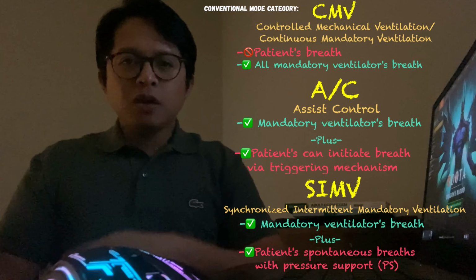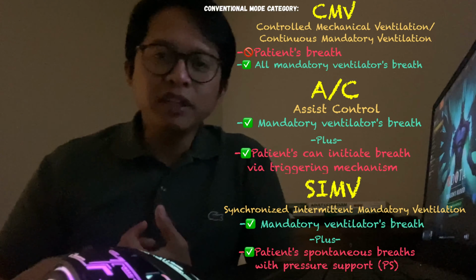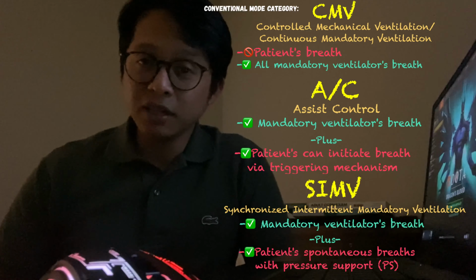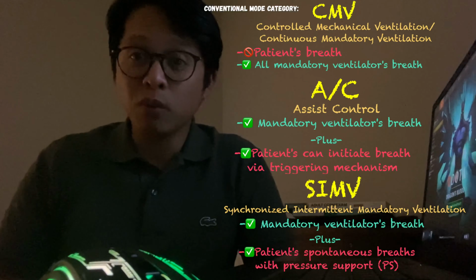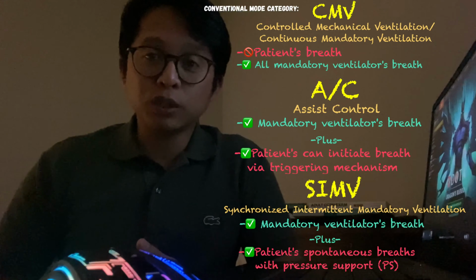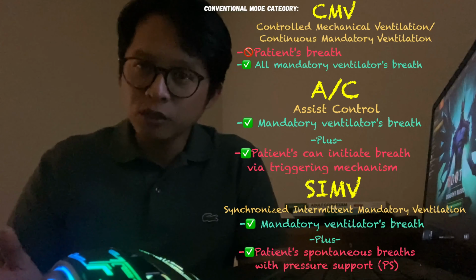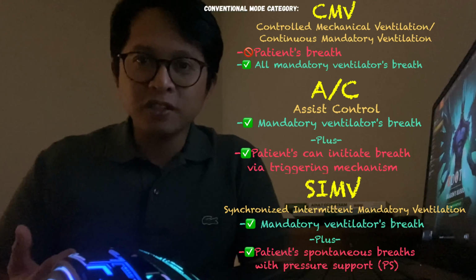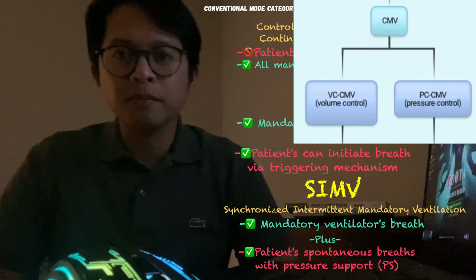So, when we say CMV mode, it's all ventilator breath, no patient effort. Patient is off limit, not allowed to have own breath even if they want to. And in short, the ventilator does all the work. This can be achieved through volume control or pressure control. So this is either VC or PC mandatory ventilation.